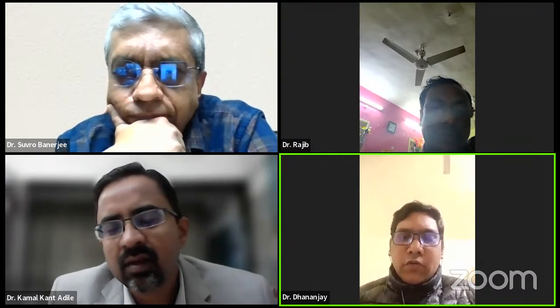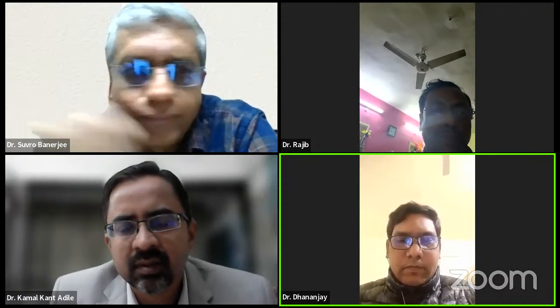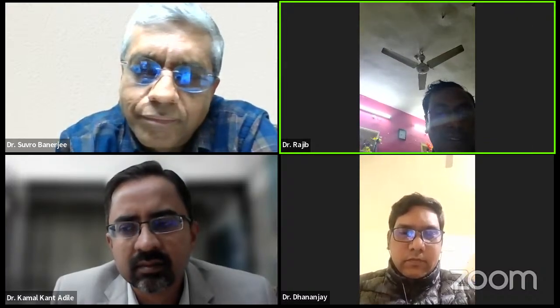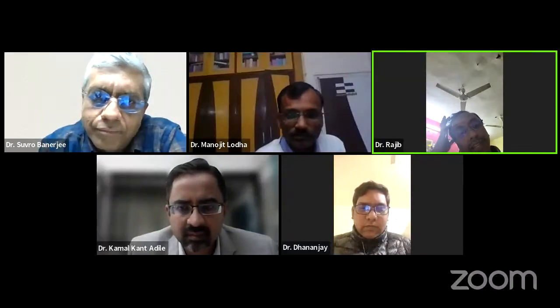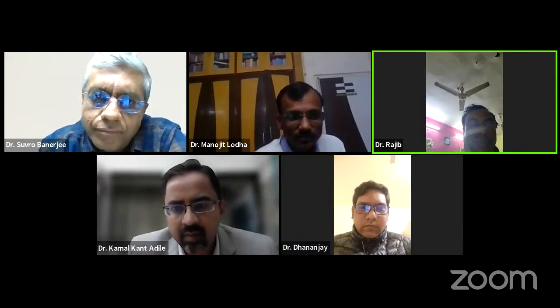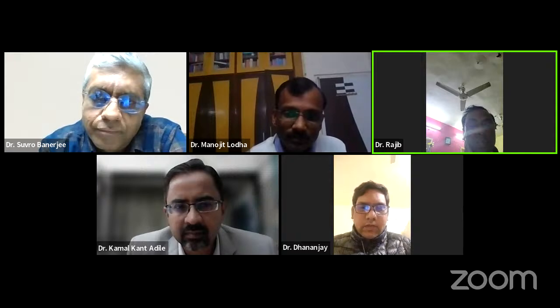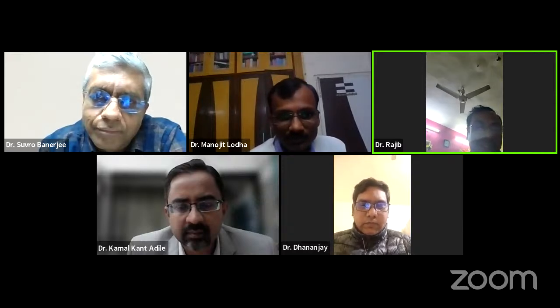Sir, how often do you use post-dilatation in primary cases? I think if you don't do it, it will be better. Post-dilatation, if there is significant stenosis, then you can go ahead. Otherwise, if you leave the patient, it will be better for you and the patient, to prevent slow flow. Others, comment please.